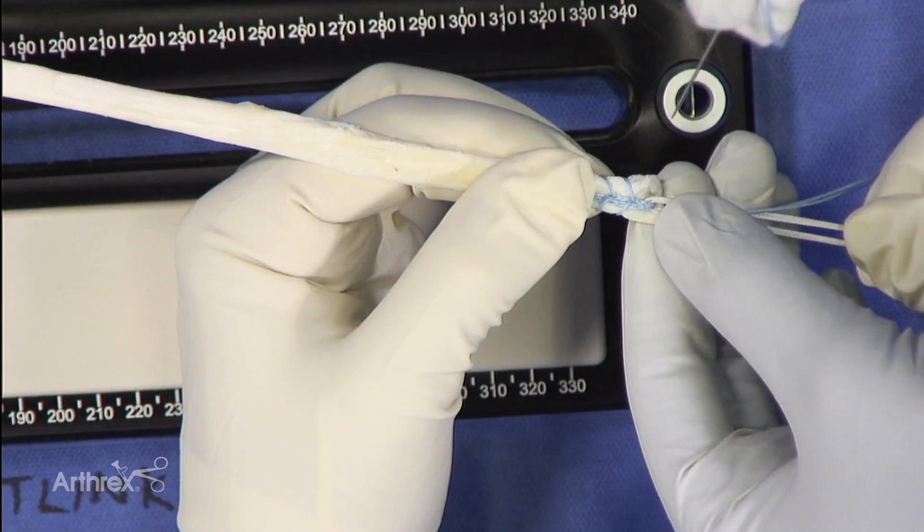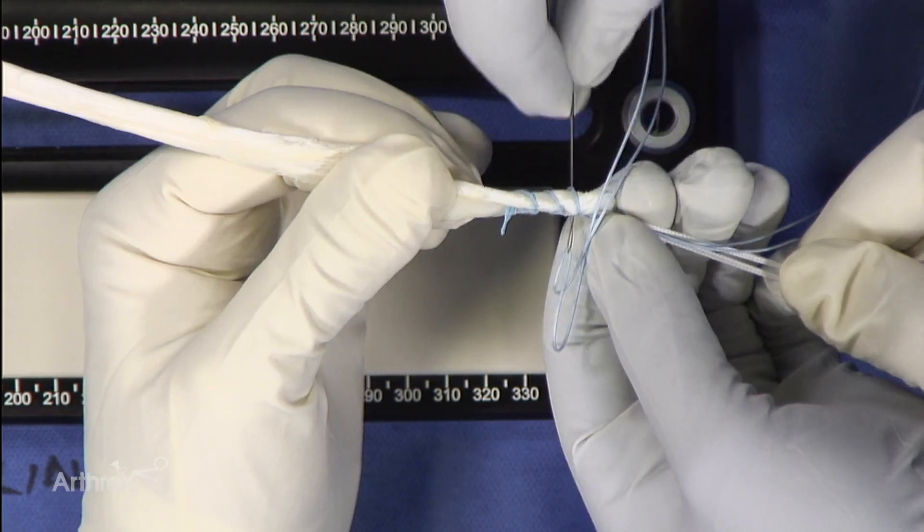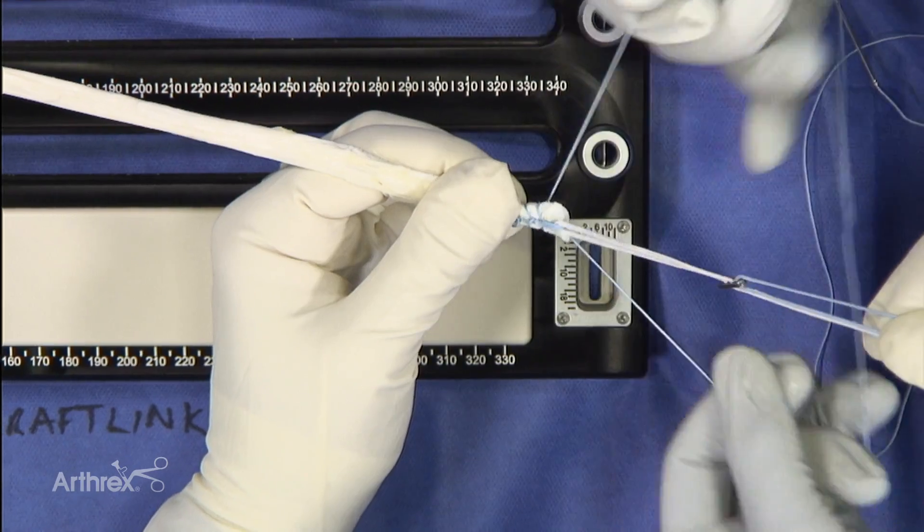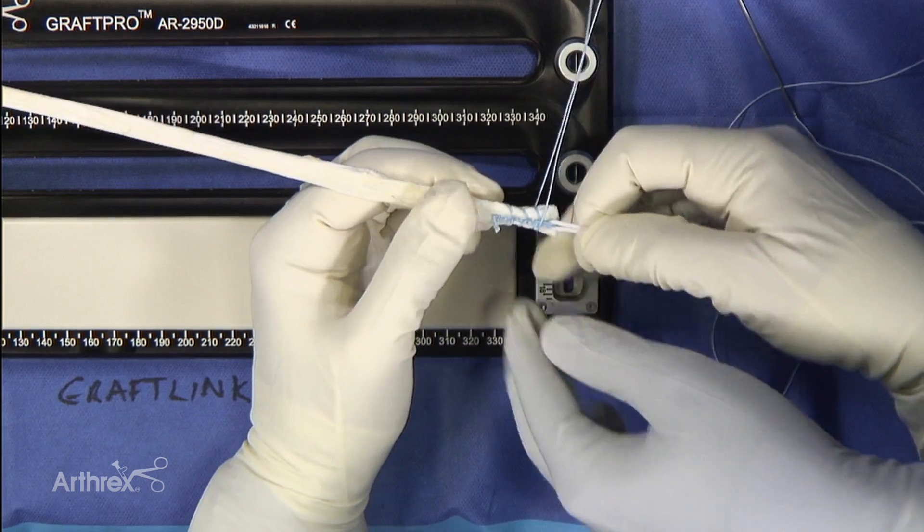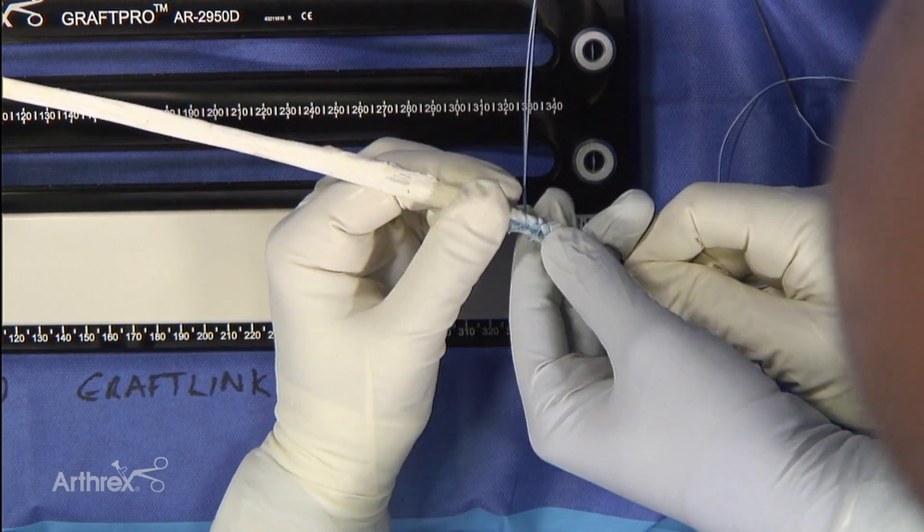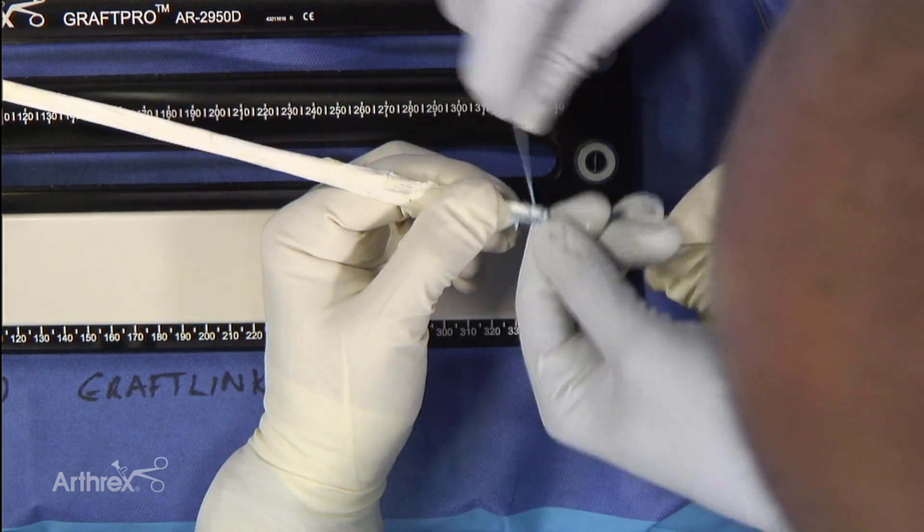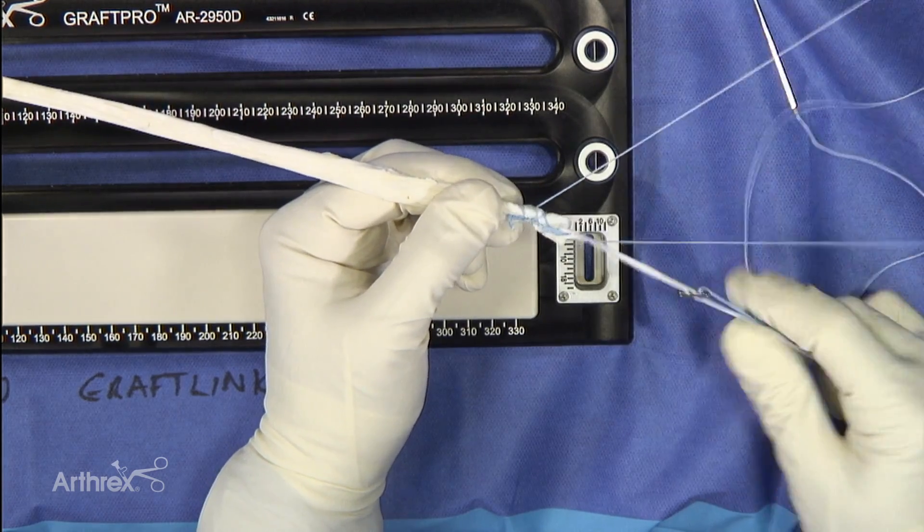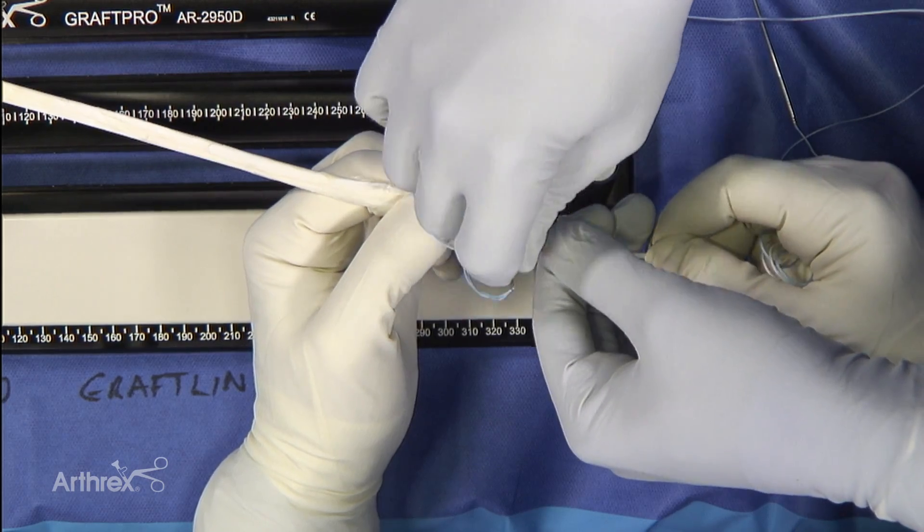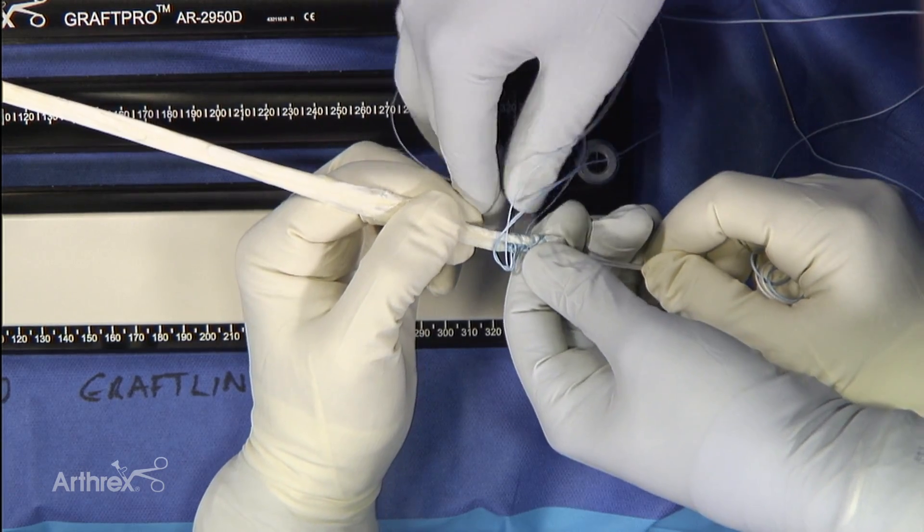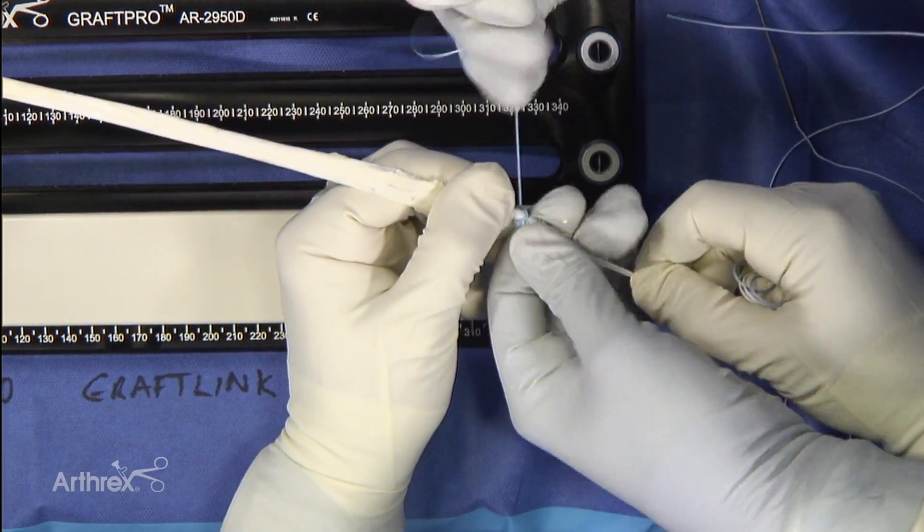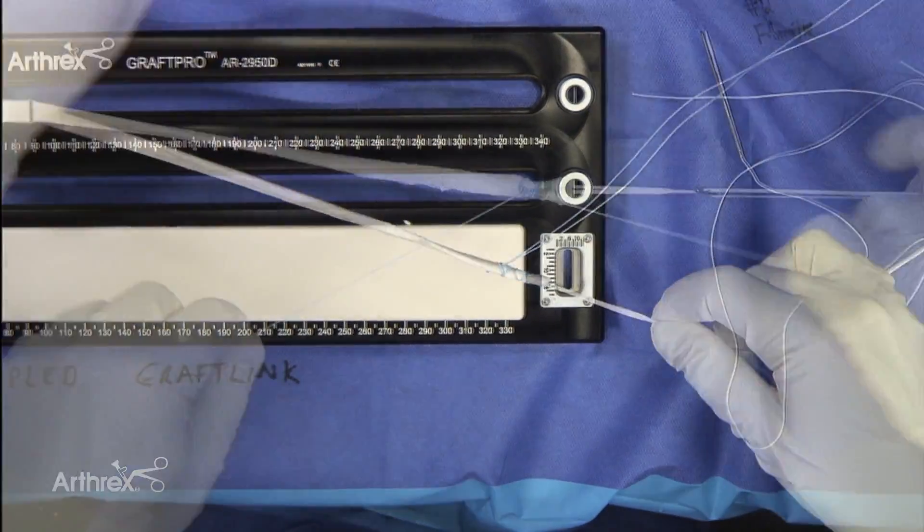So when you're tightening your RT, it won't get jammed. Now we're going to come back through. You want to independently, just like you do your standard fiber loop, independently tension the suture so it lays down nice and flush. And you can see we've come right back where we started. And now we're going to cut the sutures and we'll just tie the ends.